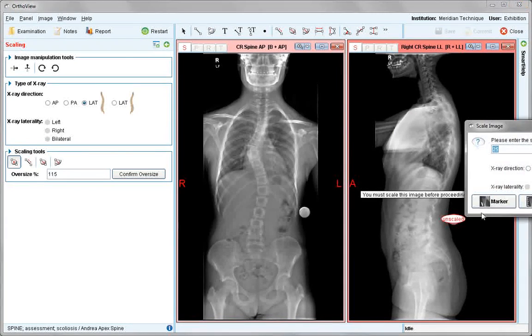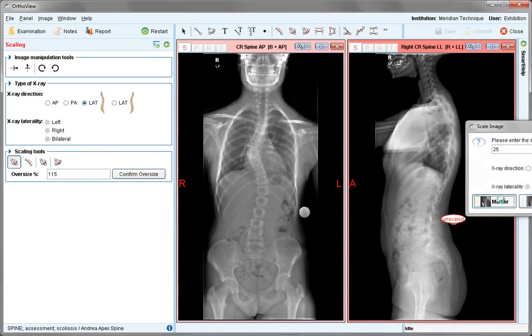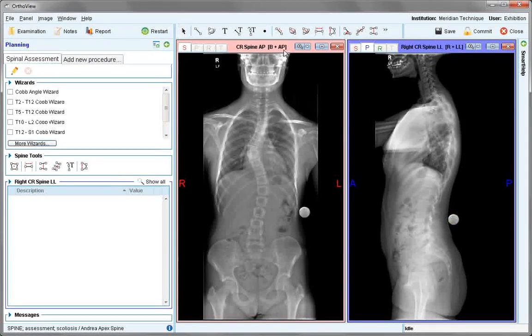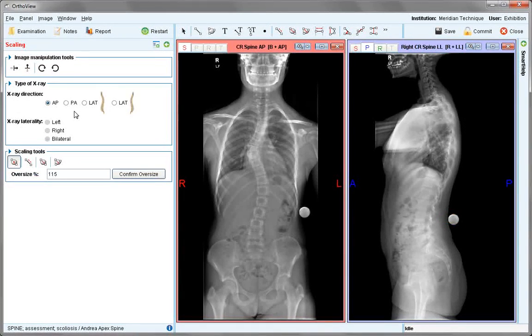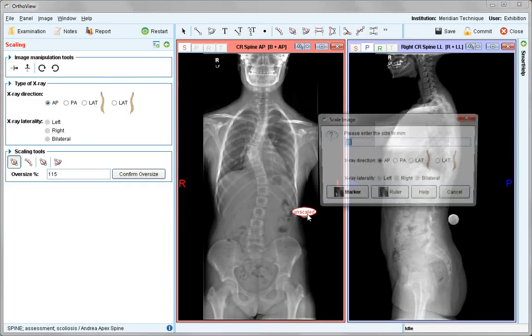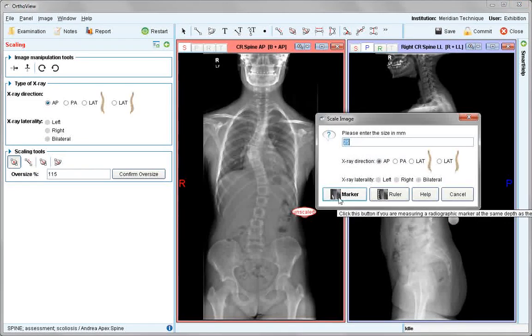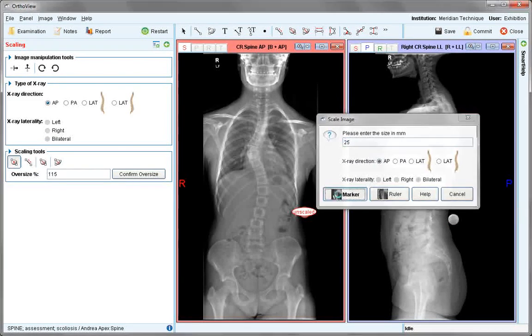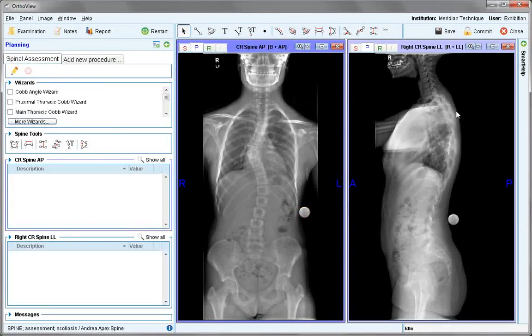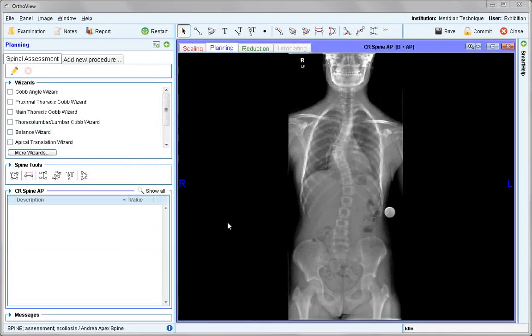Scale the image as normal using a marker. With the AP image, similarly check the x-ray direction and scale using quick scale. The lateral image will no longer be required for this demonstration and will be closed. Now working just with the AP image.